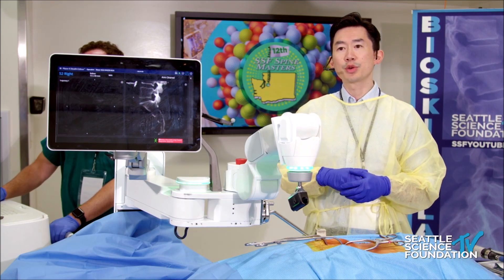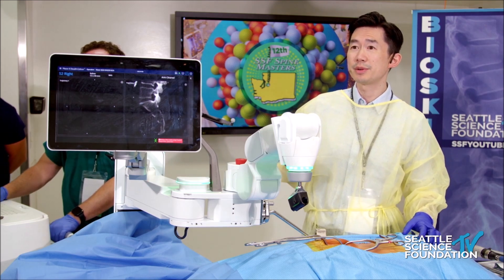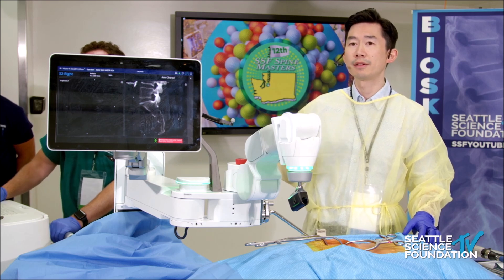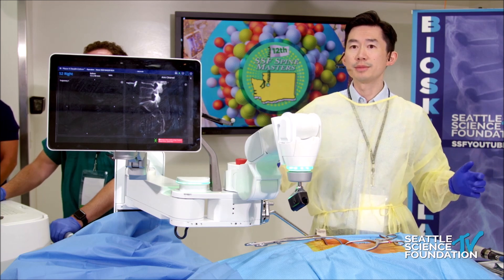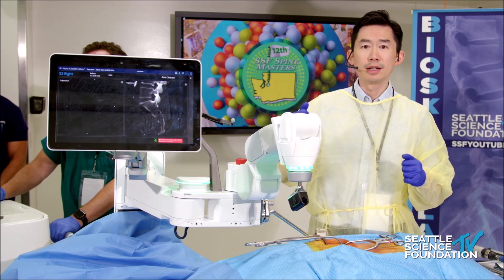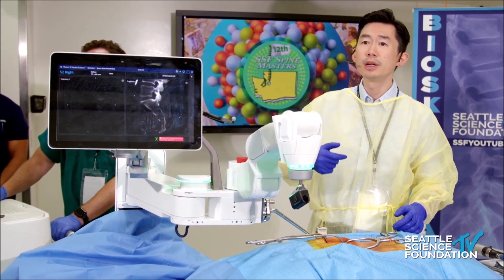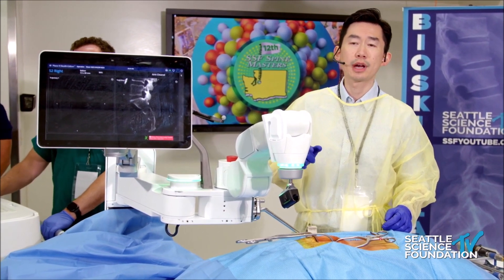Now, for the trainees in the room or the younger surgeons on this call, you may not remember a time where placement of S2ALI iliac screws was quite difficult. I've placed them freehand, learned how to place them freehand under fluoro assist, under NAV, making sure that everything lines up very well. There was a time where this was actually quite difficult. Now with robotic systems, this just becomes like another mundane screw, essentially as it should be. Because as the foundation for your deformity, it should be straightforward, and you shouldn't be going in and out and troubleshooting and repositioning. This should be the perfect screw that first time around.